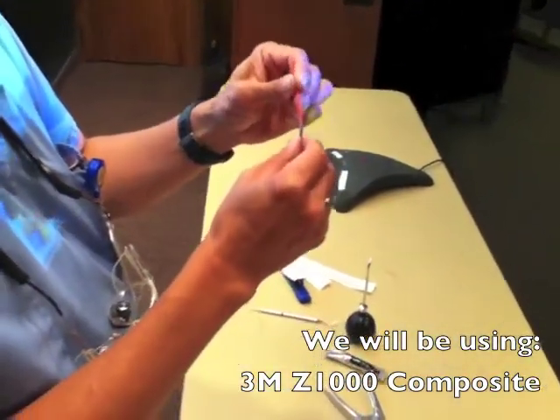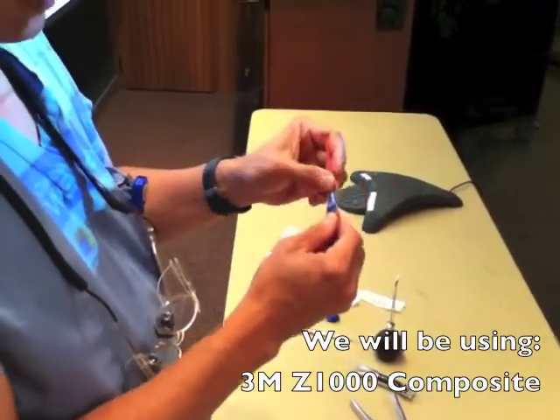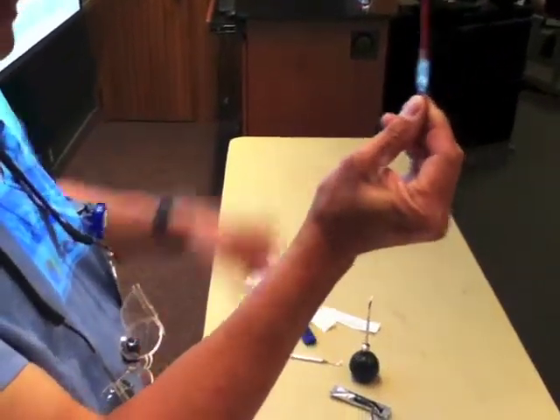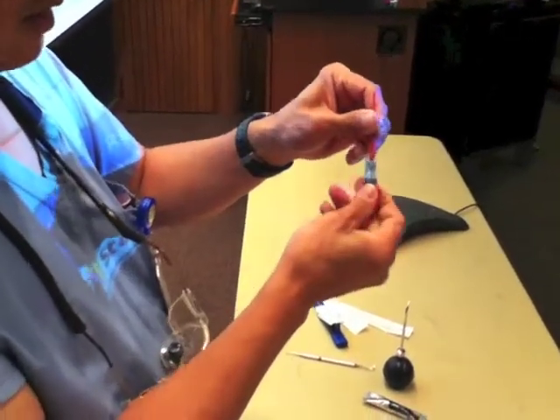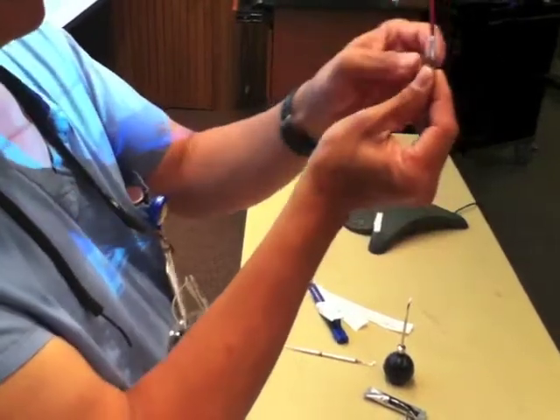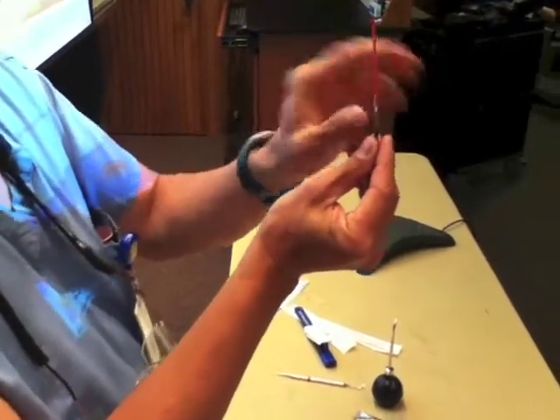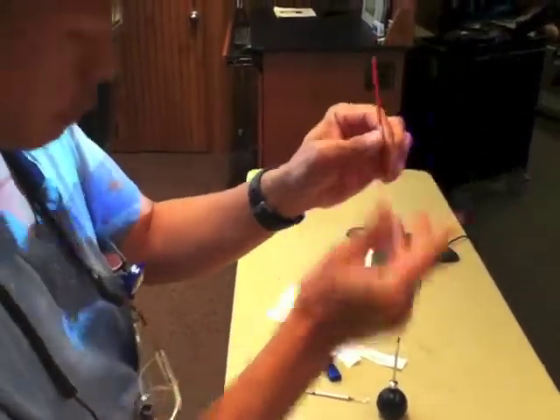All you have to do is swirl the tip. With this, it's relatively easy — just squeeze this and you'll hear the pop. That's why they call it Prompto Pop. It'll squeeze the bonding material right up into this area, and then all you have to do is swirl it around — about five seconds. You can leave it in there because this cures with light, so as long as it's in the packet, you're in good shape.